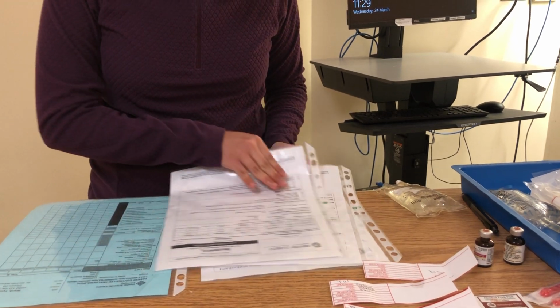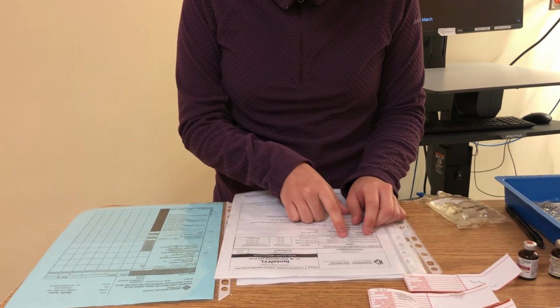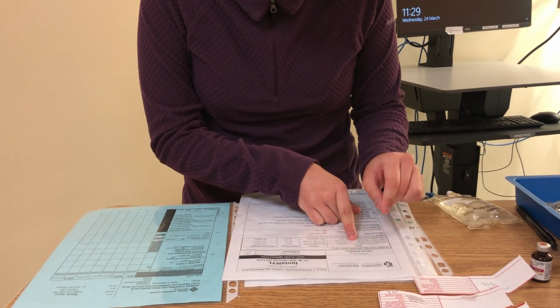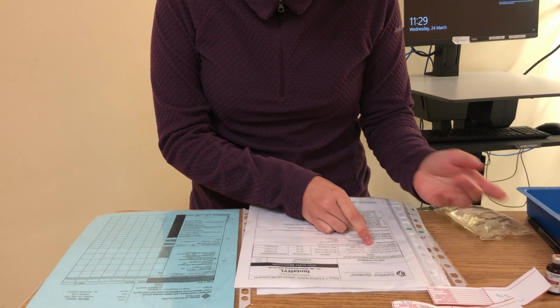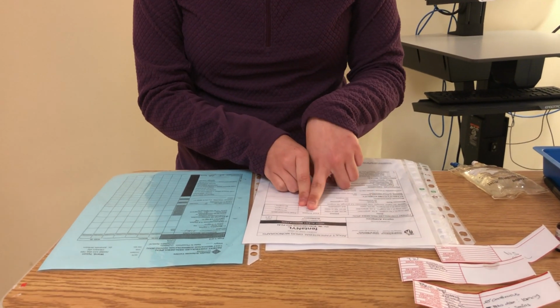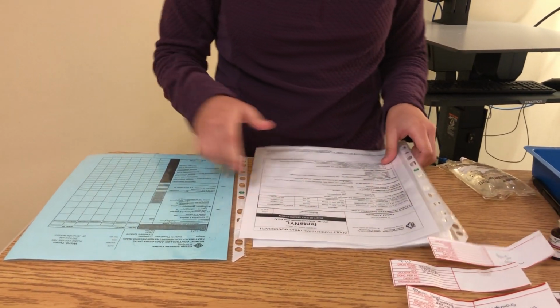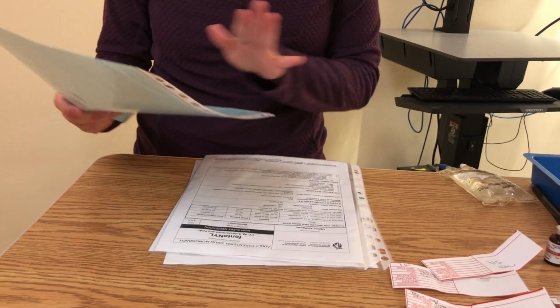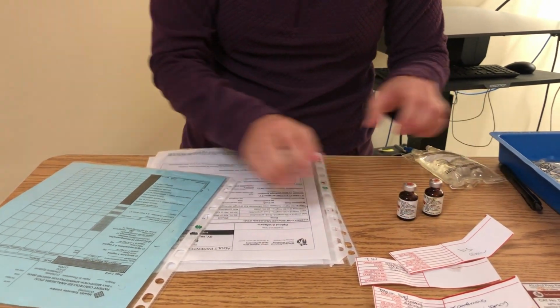And as for my recipe here, for my 10 micrograms per ml, in order to get that, I would get 500 micrograms. So I need 2 vials that have 50 micrograms per ml, and then dilute it in 40 ml of normal saline with a final volume of 50 ml and a final concentration of 10 micrograms per ml. So now that I've reviewed that, I'm going to do my first check with my MAR, my PDM, and then my medication here, which I got from the Pyxis.